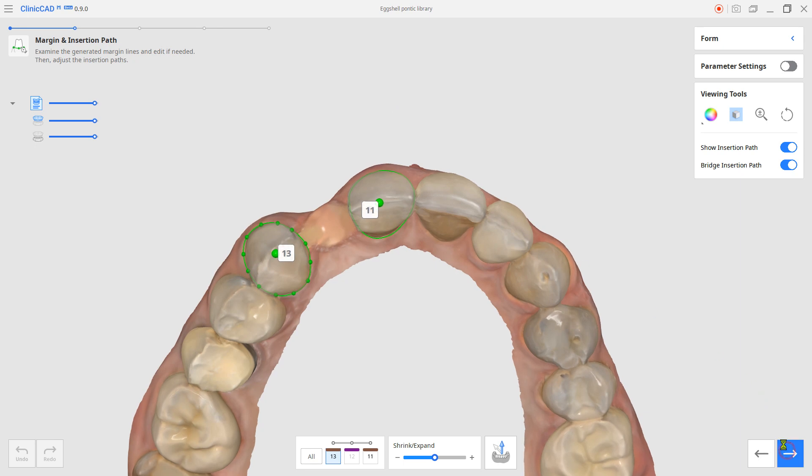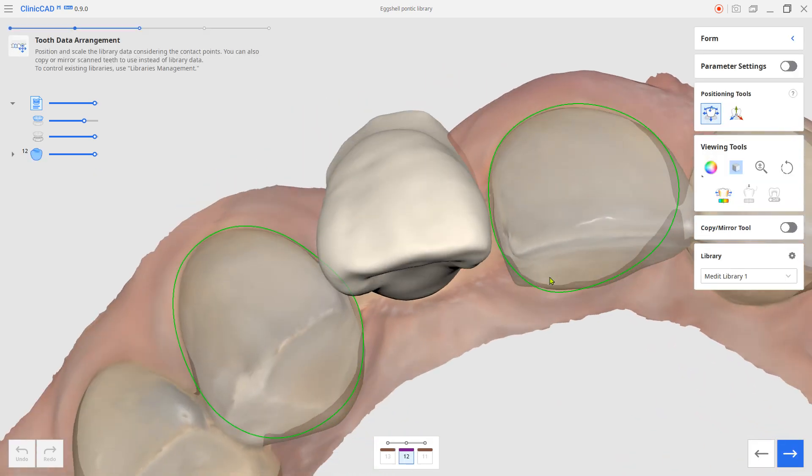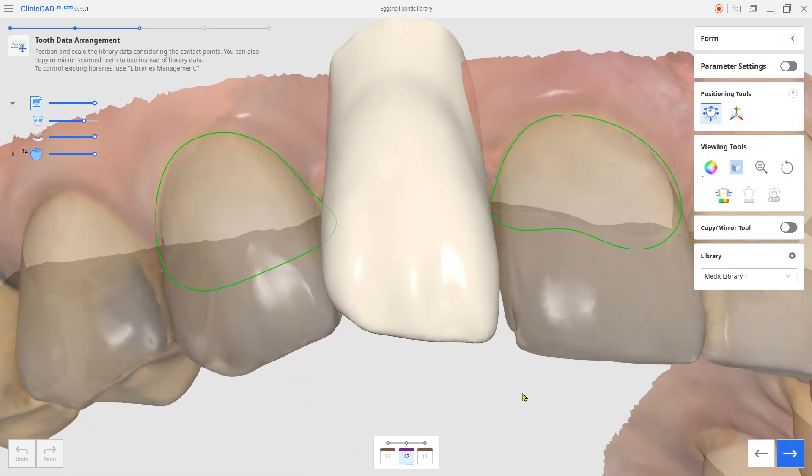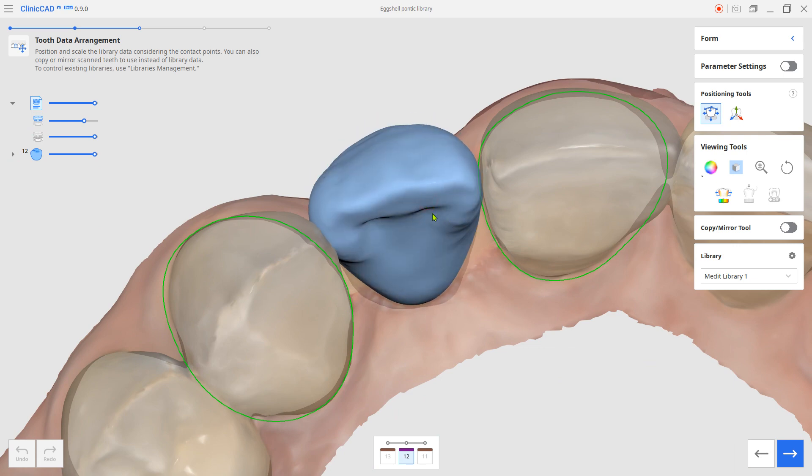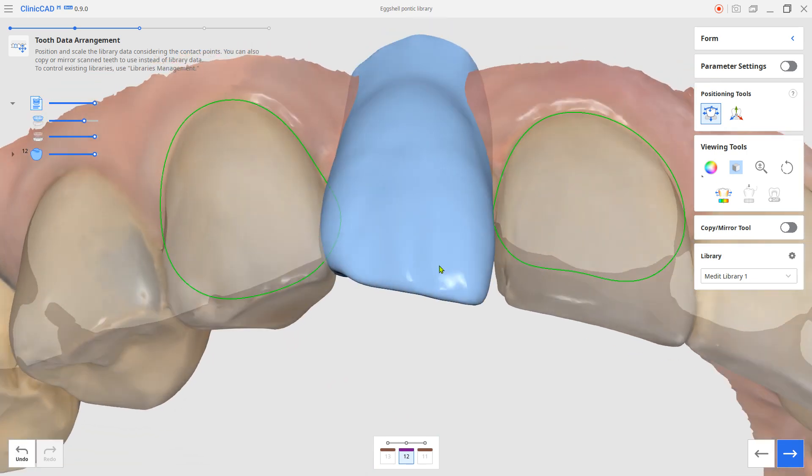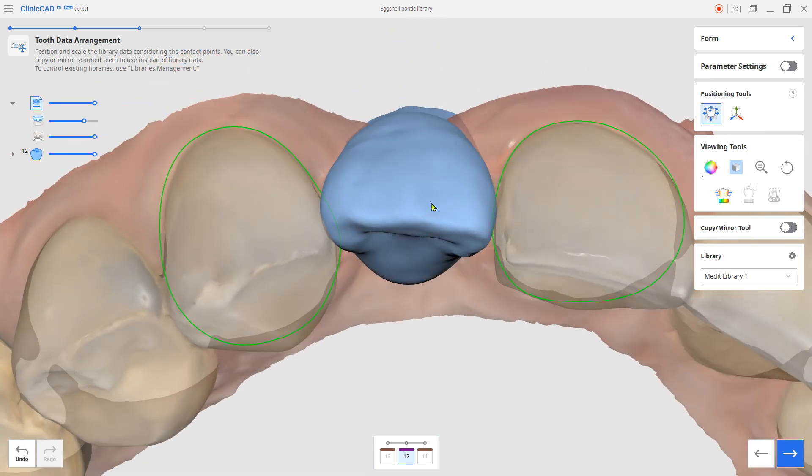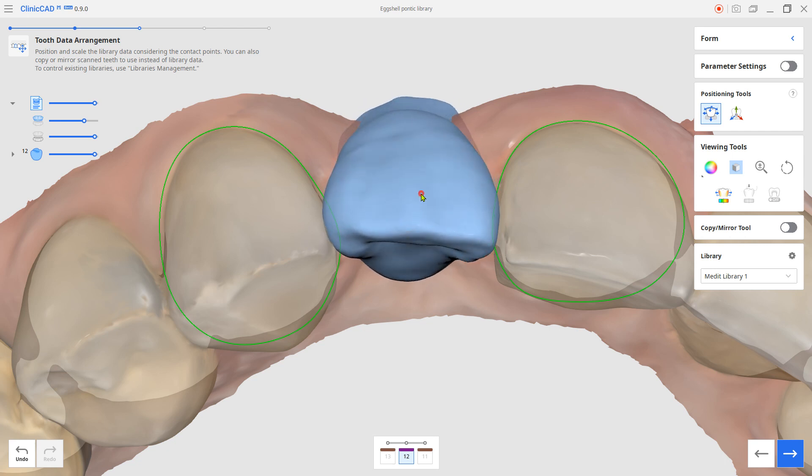Next, the system will spawn the Pontic teeth from the library. Set the position. Press and hold the Ctrl key to rotate. Press and hold the Shift key to scale.